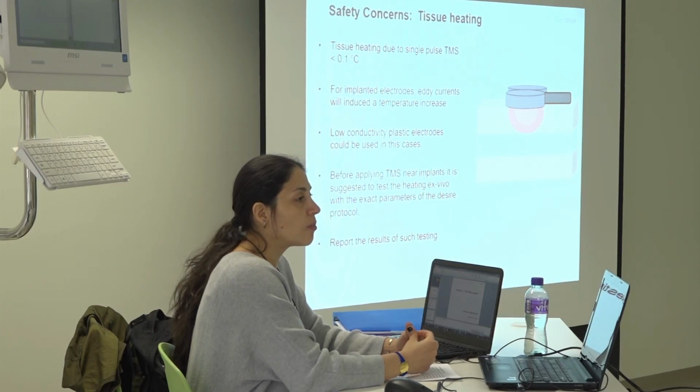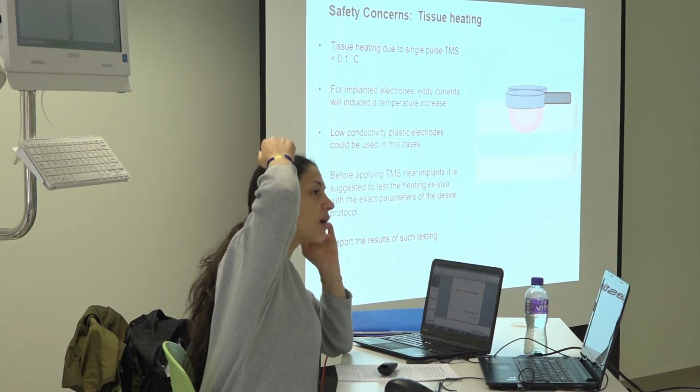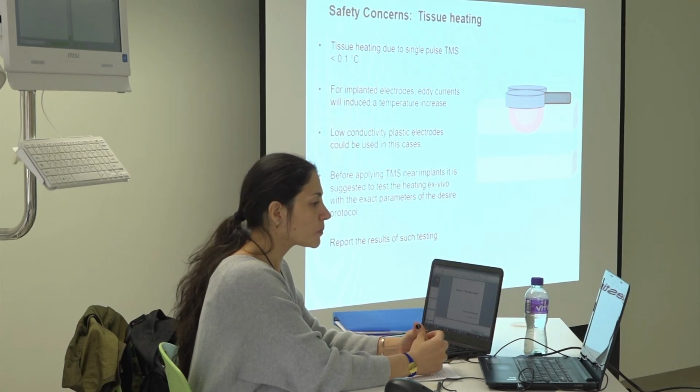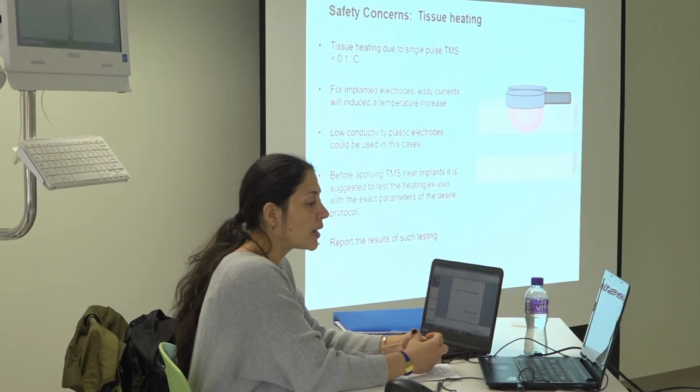But we are not going to work with implanted electrodes, right? You are going to work with healthy people, not people with epilepsy or whatever who have some electrodes implanted. So we are not going to work with these participants or patients. But anyway, I thought it was good to mention it. In this case, when you have implanted electrodes, they will need to use low conductivity plastic electrodes. It will be better.